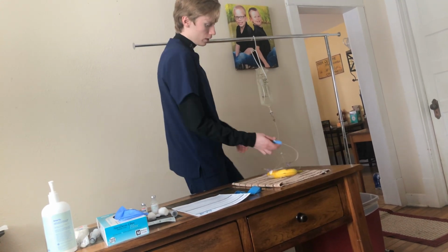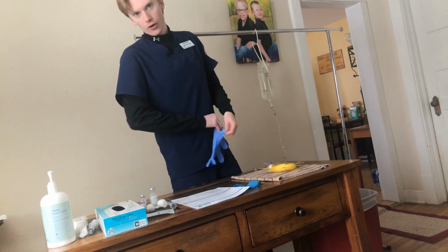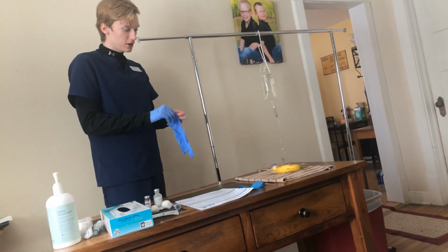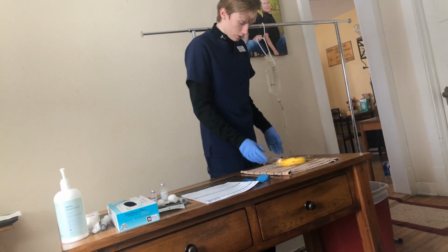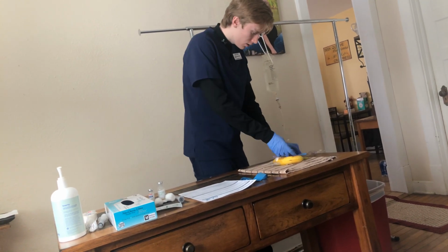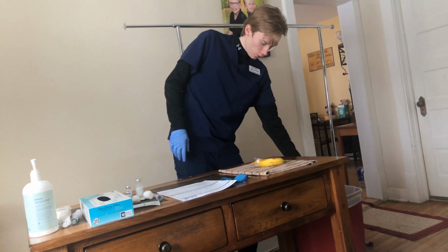So I am going to clamp this. I'm going to put on gloves just because I don't know if it's necessary or not. I'm going to do it anyway, just because I'm getting near that IV site. So now that I have these on, I have clamped my medication. We are good to DC it, so just remove this right there, easy peasy. Remove it from the IV pole and discard it in the appropriate disposal bin.